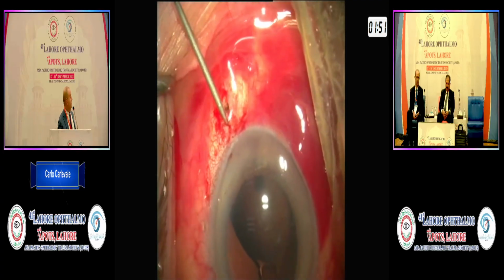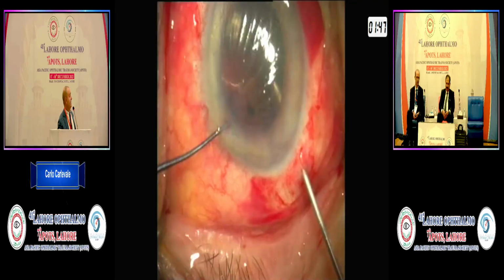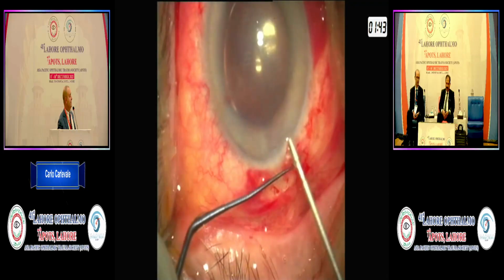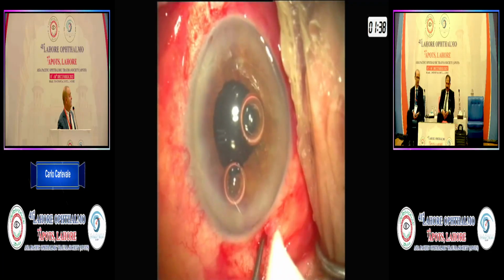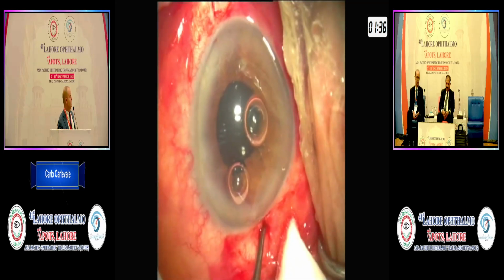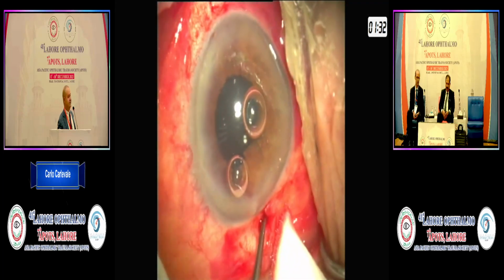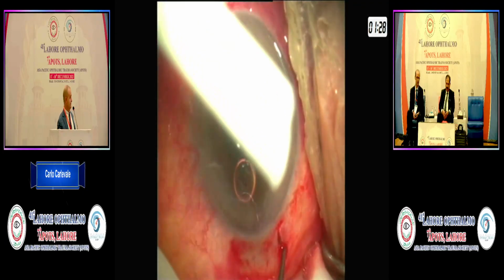At the same time, the forceps should externalize the plug, and temporarily the plug is on the surface of the sclera to avoid dropping the lens down. Then with a microforceps, you can bury it and move the 2 wings of the plug in the 2 small pockets you have previously sculpted. And the procedure is finished.